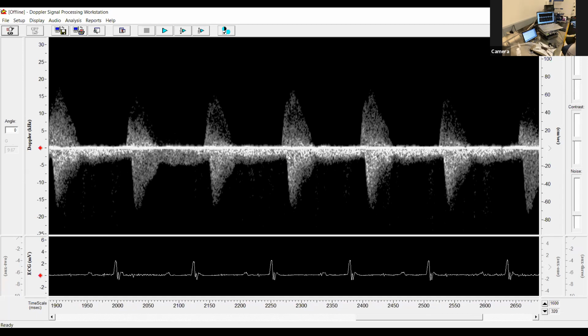Again, as the animal ages, as it gets older, those things are going to change due to arterial stiffness. So this is a really great way to measure it. Other ways can involve doing sequential measurements of flow at the arch and at the abdominal aorta. They can be less accurate, perhaps more susceptible to changes because there's changes over time in how the animal's heartbeat is going. Small changes make a big difference. So doing it simultaneously with two probes on the same system is really the best way to make this measurement. And there's a number of different papers published using that technique.